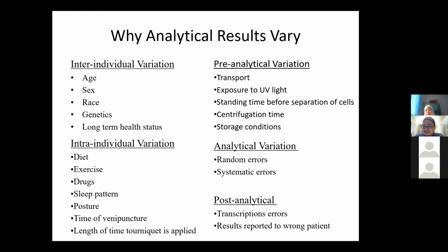And you notice that the results are normal, but they vary. Macam semalam saya cakap apa, there are range kan for red blood cell, white blood cell, okay, and they vary. If we have not established what is normal, if we have not established the normal range, when you look at these results, 100 of them, with various variations, what do you think would occur? Won't the personnel become, I mean, confused? Yeah, should I accept this result or not?